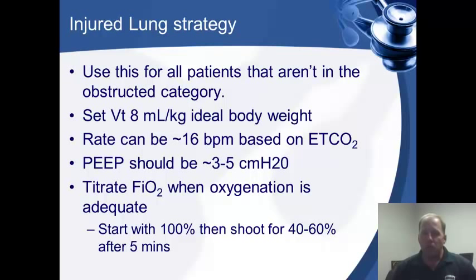Now, should this be a pulmonary edema patient or a near drowning that is starting to shunt some fluid, you may have to increase this PEEP a little bit. Just be mindful of the blood pressure. High PEEPs always cause a little bit of blood pressure drop. You want to balance this out and not go too high. You want to titrate the FiO2, like we talked about before. Do 100% to start off with. In about 5 minutes, you can wean this down, because we're shooting for SpO2 somewhere around 95 to 99%.